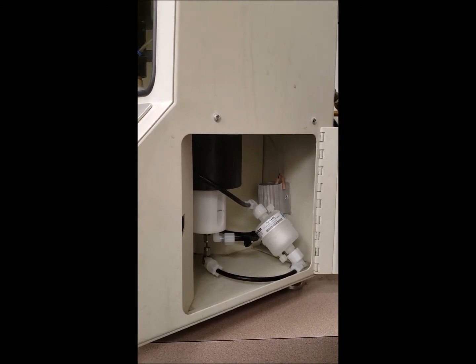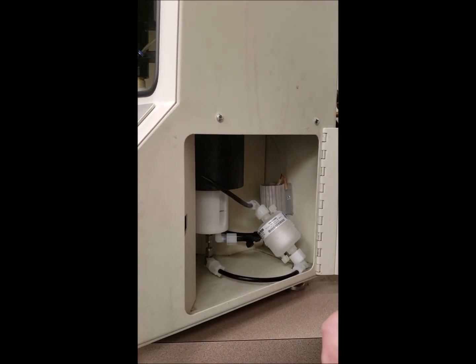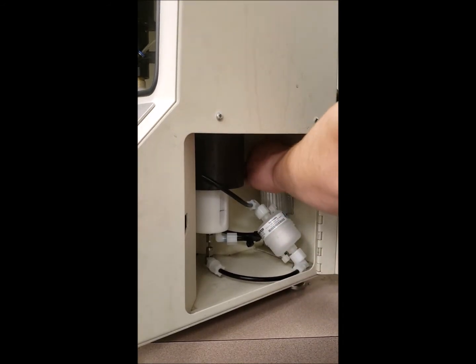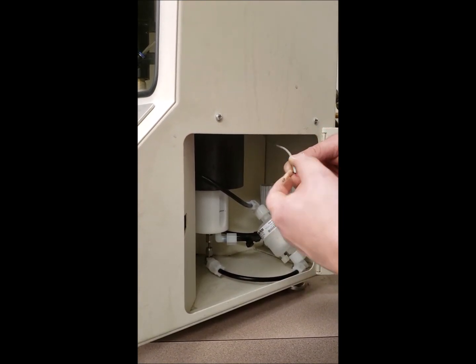If you're having problems with your coating pump not pumping coating accurately, and you have double checked your system for any kinks in the lines, what you're going to do is remove the coating pump harness from the coating pump.